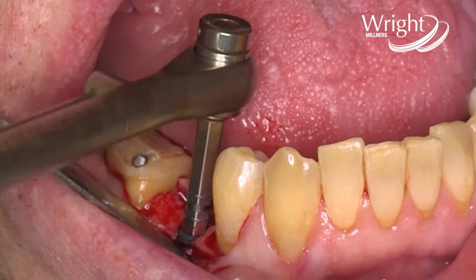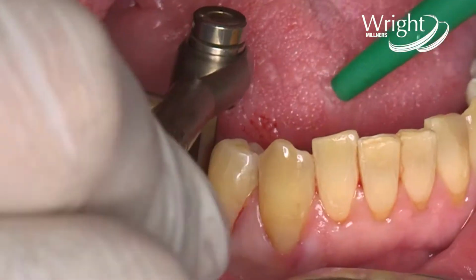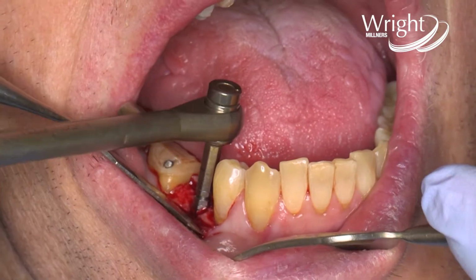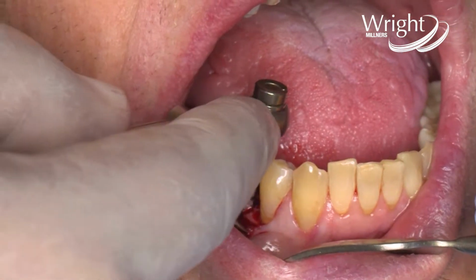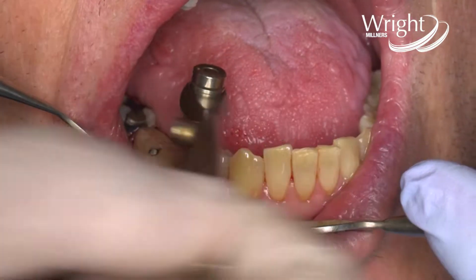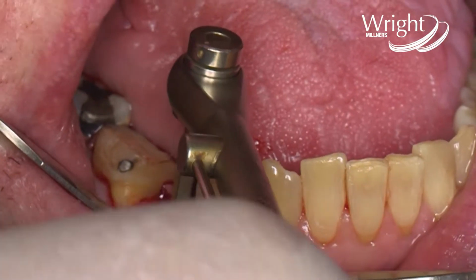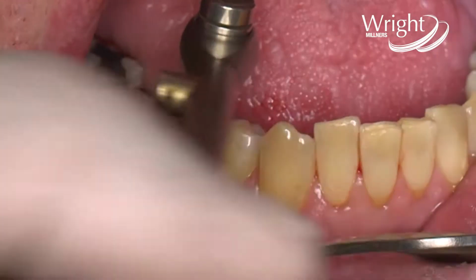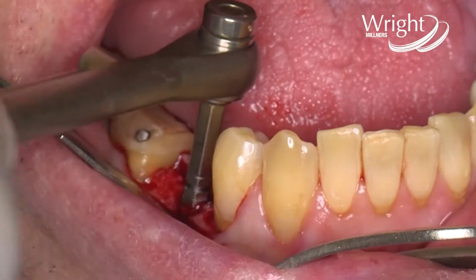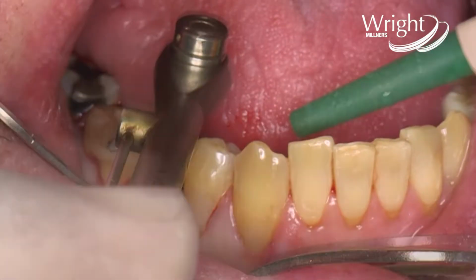So now I can go with my torque wrench and I turn it in. Now you'll feel it starts biting tighter. Remember, bone is a living tissue and it needs to stretch, so we will reverse it a little bit because we don't want too much pressure on the bone, otherwise we get necrosis. So a few turns to reverse and then we go in again. But you'll see, even if I do this, I'm not sacrificing my primary stability. I will still end up with quite high primary stability.